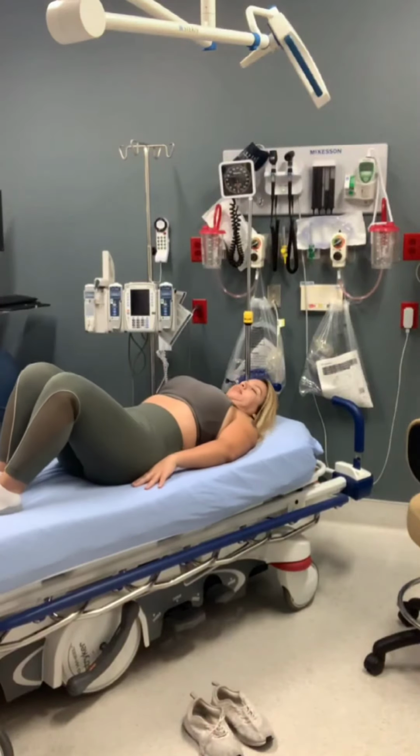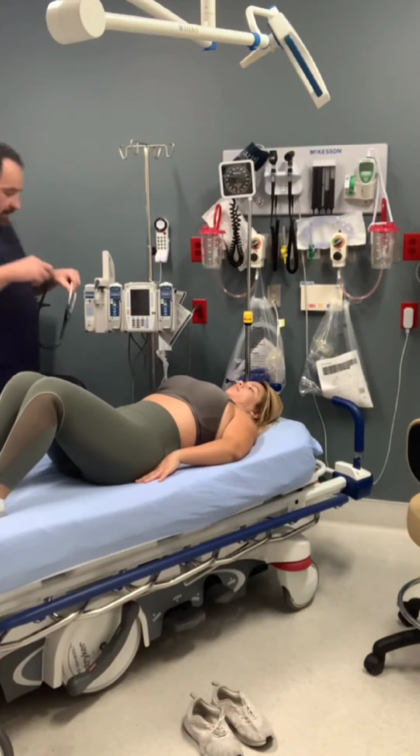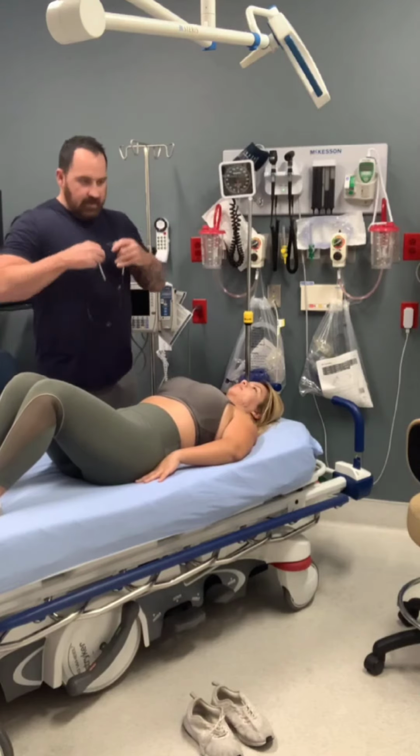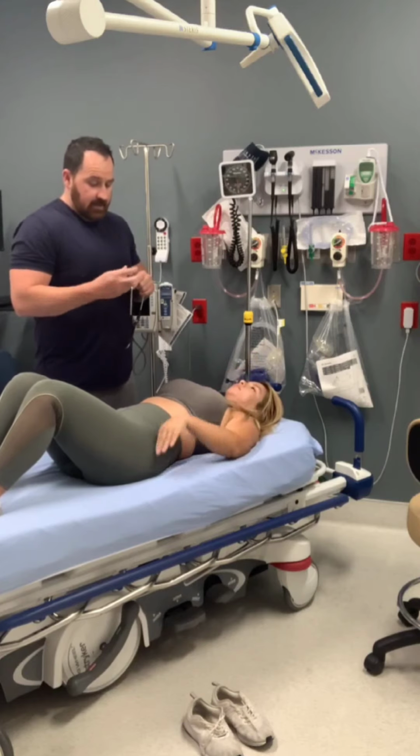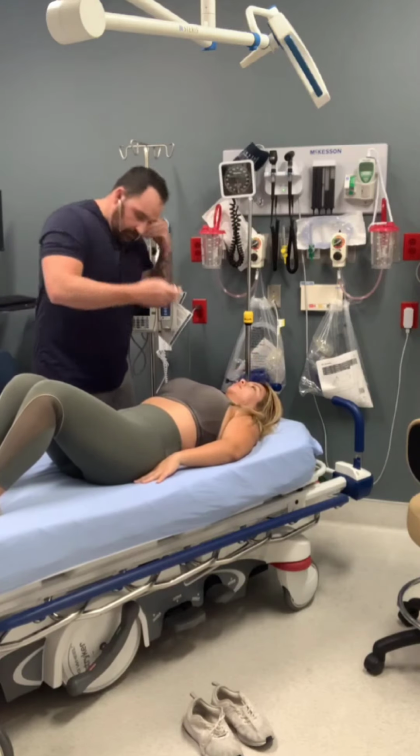Move your stuff out of the way. All right, so at this time, I am going to listen to the 5 precordial areas again, starting with the diaphragm of my stethoscope.